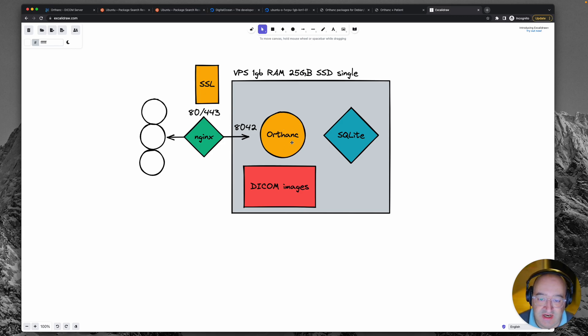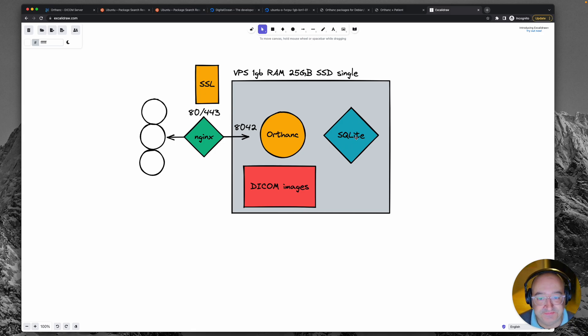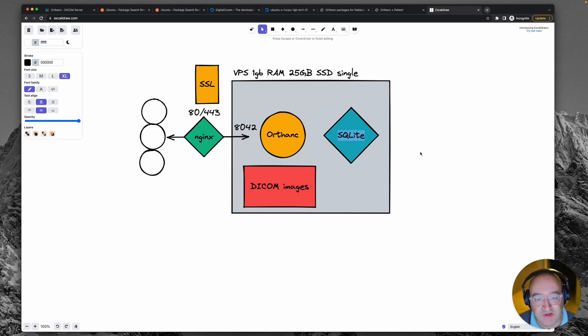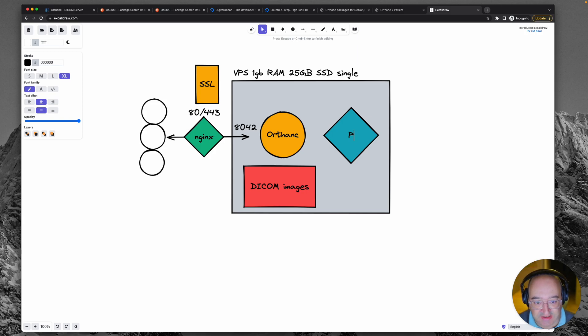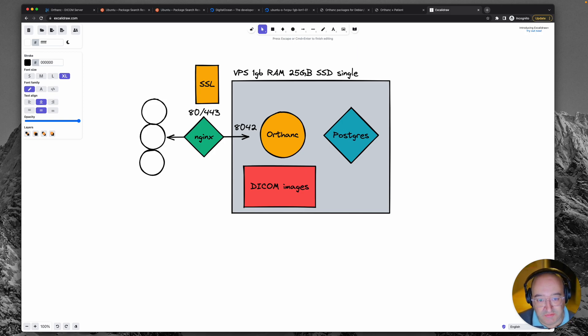The next thing we need to address is the database. So we're going to quite simply swap out the database with a more robust one called Postgres SQL.